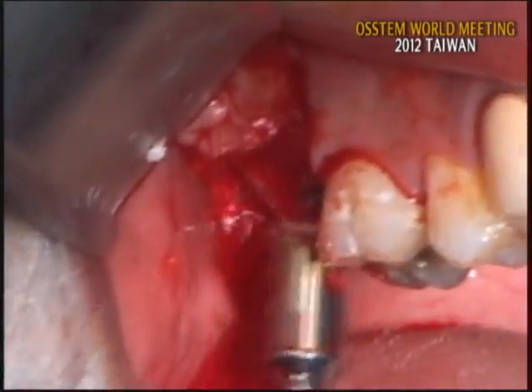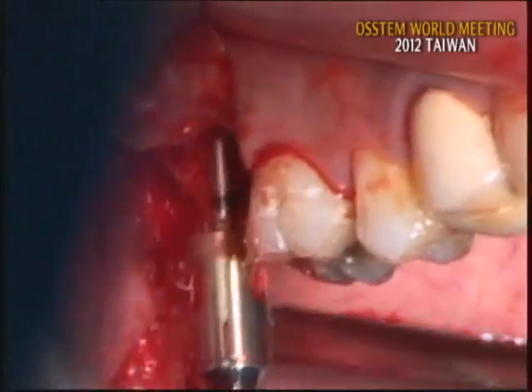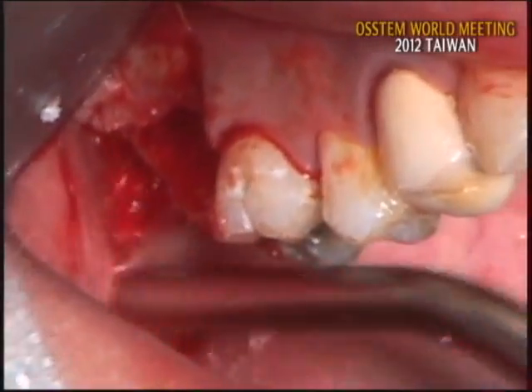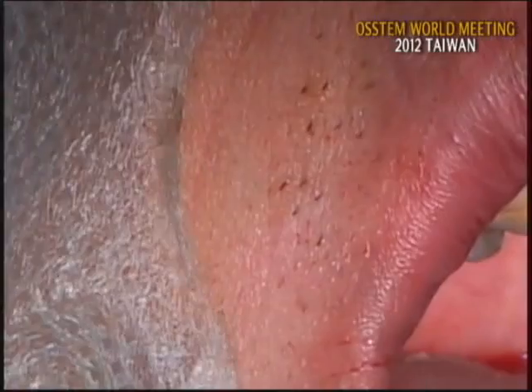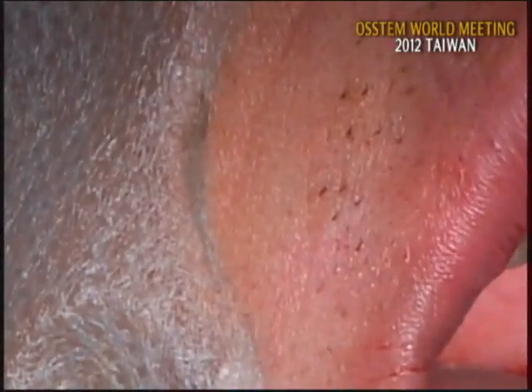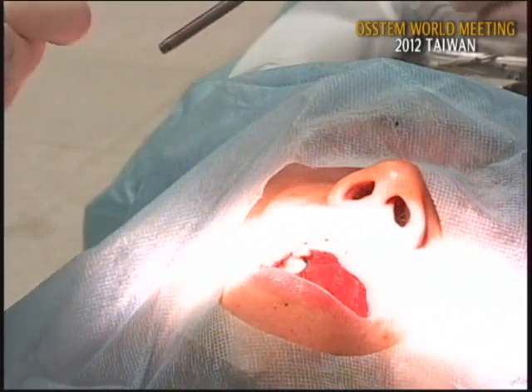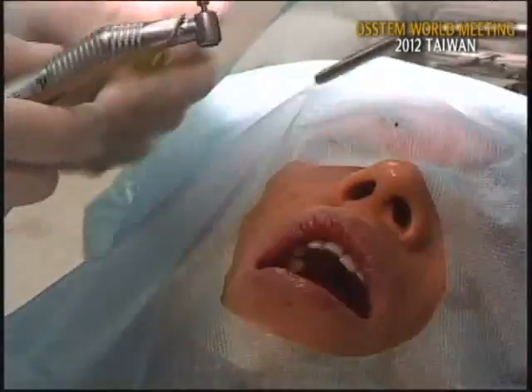These days, some dentists suggest no bone graft when the bone height is more than 7 millimeters. I also think so. Even without bone graft material, we can make some amount of bone. And when the remaining bone height is more than 7 millimeters, even without bone graft, usually the implant can survive. Okay, the bone graft is finished, so I'll place the implant.